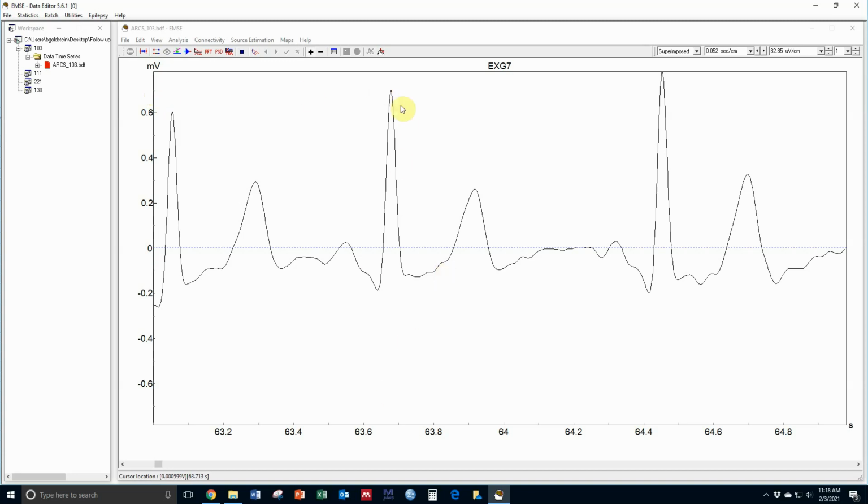So I'm going to go ahead and put 0.7 into that Google sheet. But you can tell that this is just like one example. So this one is going to be much higher than that. This one is closer to 0.6. And this doesn't really matter. And you'll see why it doesn't really matter so much in a little bit.